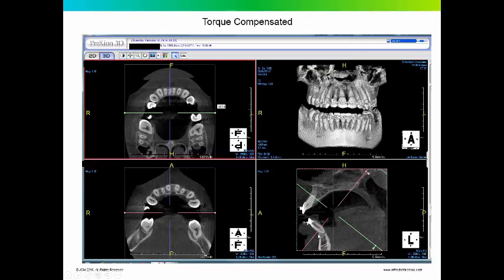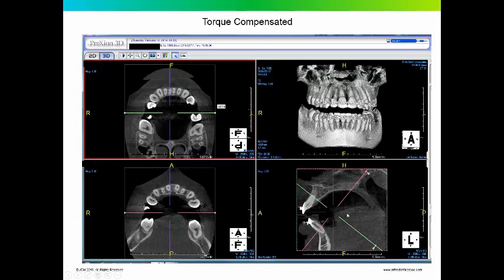Here we've compensated for the position of the tooth. We're looking straight down the long axis of the tooth, and we start to pick up bone right about here where this red line is. And this axial view shows that that's where the teeth start to be surrounded by bone.